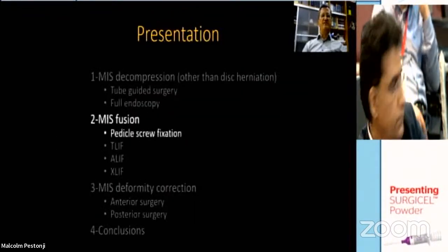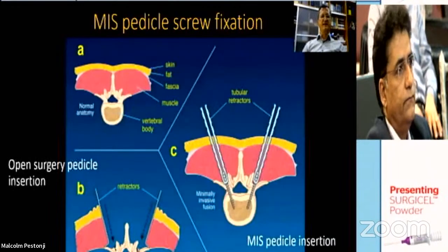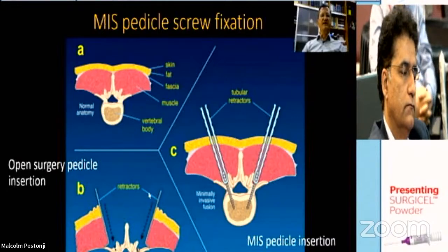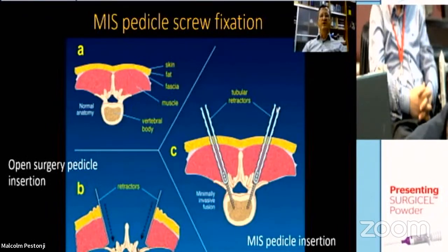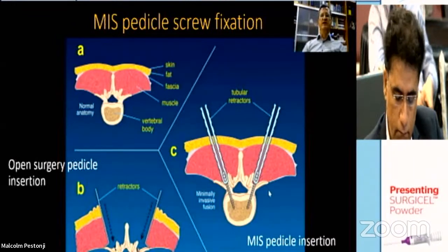What about MIS fusions? First of all, pedicle screw fixation can be done by MIS techniques. If you look at the opening in normal surgery, this is what happens with retractors. There is a significant amount of muscle damage. However, with MIS pedicle insertion, you can place them through the muscles. So then the muscles are mostly protected.